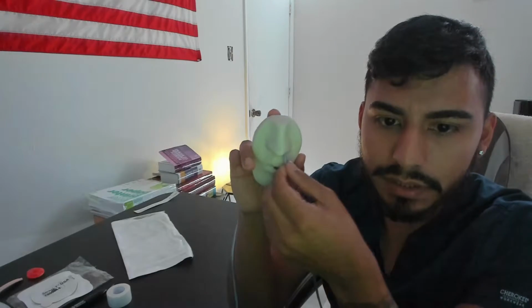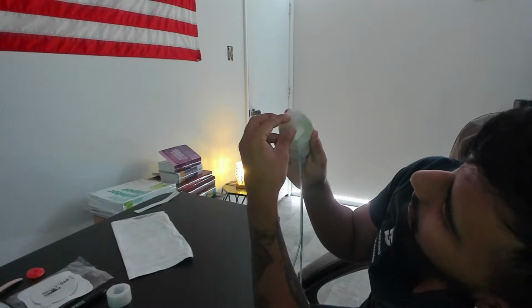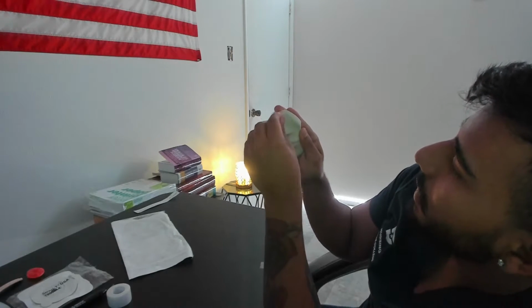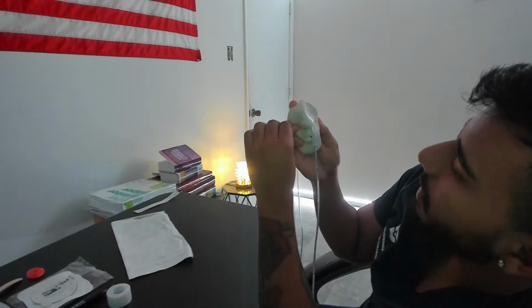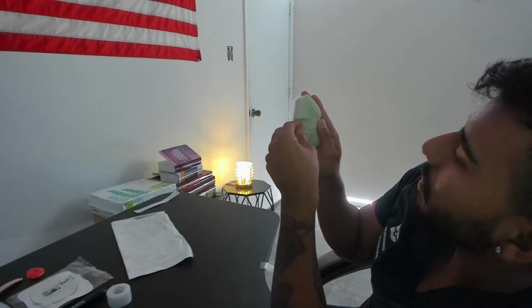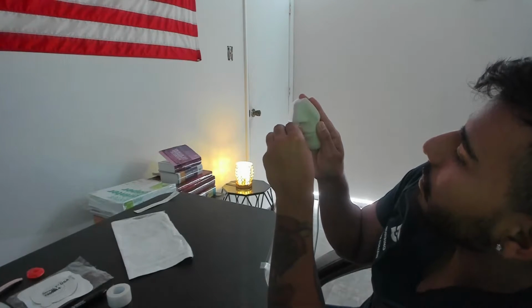I'm not sure if you can see or not. The tape is really transparent, but it's right here. So I'm going to grab my tape and attach it to the middle of the nose. Again, this tape is not really that good, but we're going to do our best. I get one piece of tape, attach it to the side, then get the other piece of tape and go along with the tape mark.